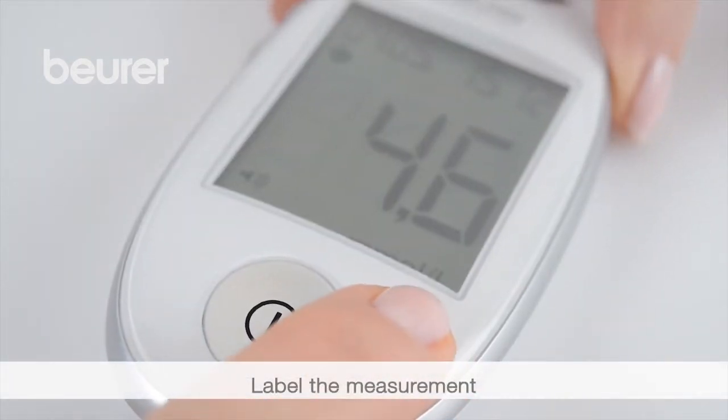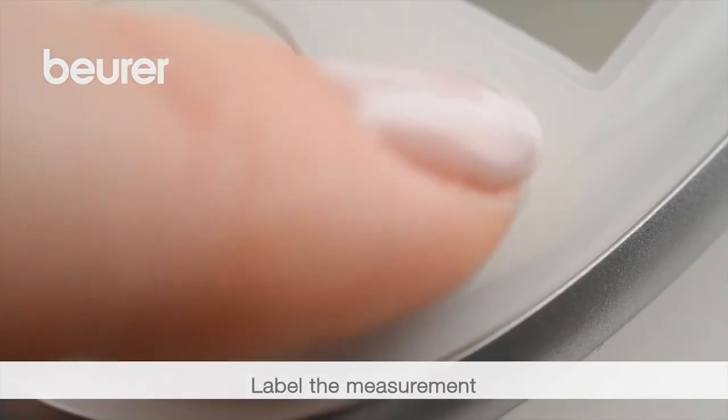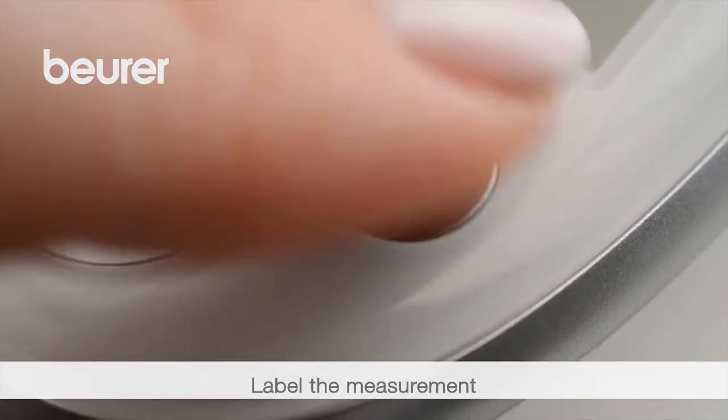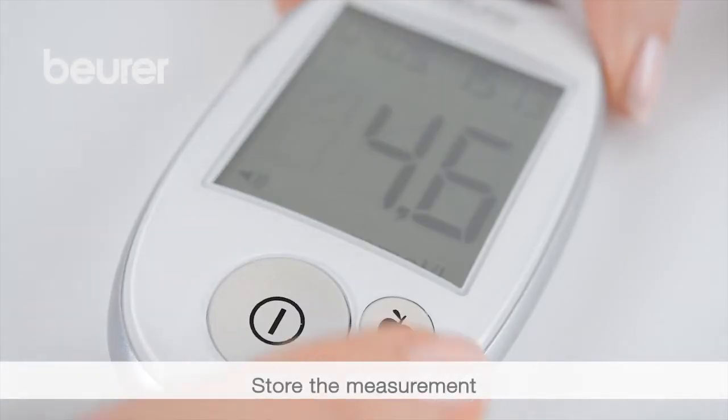For a measurement before a meal, press the apple button once. For a measurement after a meal, press the apple button twice. For general labelling, press the apple button three times. The measurement is stored.